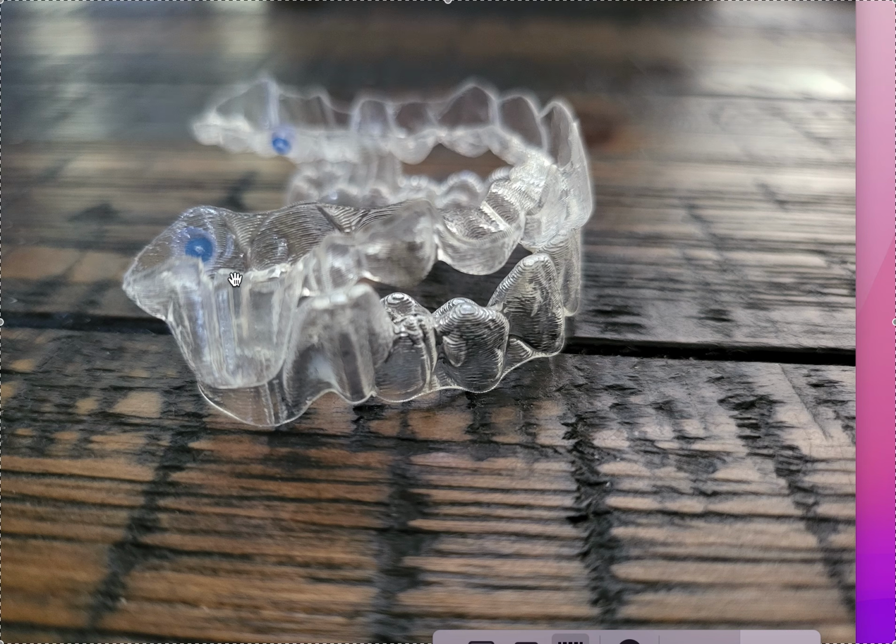So basically it's an Invisalign with a little ramp that comes here. And this patient, for example, probably had like an 8mm overjet. So this ramp slides the lower Invisalign forward so that the lower jaw is sitting in an anterior position for a long time while you're straightening your teeth, while you're leveling the arches and doing other things at the same time. So we're doing everything all at one time. We're growing a jaw, we're straightening the teeth, right? So that's basically it.